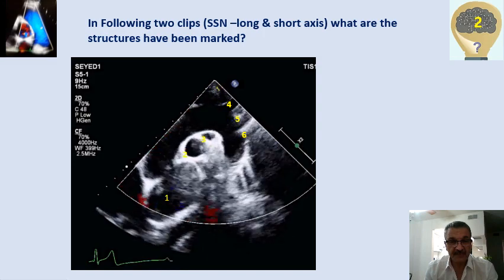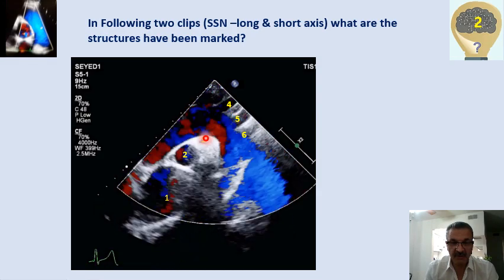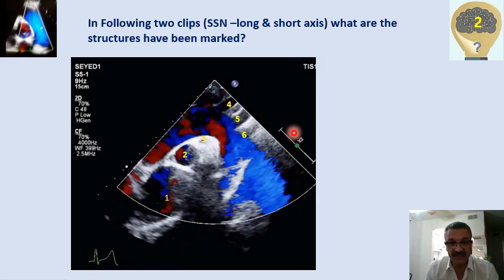We have two clips, both of them are a suprasternal notch. The first one is long axis, as you see here. I want you to determine each structure and what is the name of those structures. We have one rectangle. Assume all of those structures are anechoic. This one, and second one, this circular shape, third one, this almost elliptical or half partial circular shape, and these three cylindrical structures. There is another structure here — if you can name it, we are going to test your ultrasound physics and anatomy knowledge.